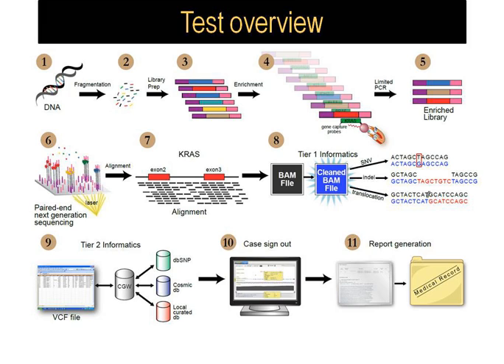but we fragment the DNA and we make a library using Agilent SureSelect method, and after the sequence is captured by Illumina HiSeq 2500, we align the data, and then depending on what we are looking for, we have several different bioinformatic tools which we use for SNV, indel detection and translocation.